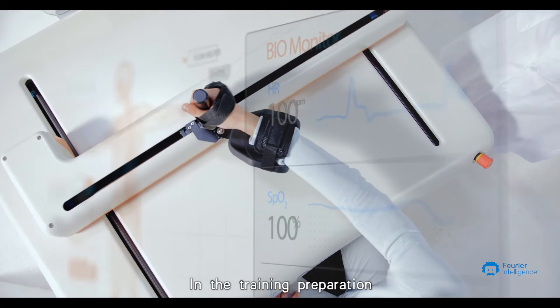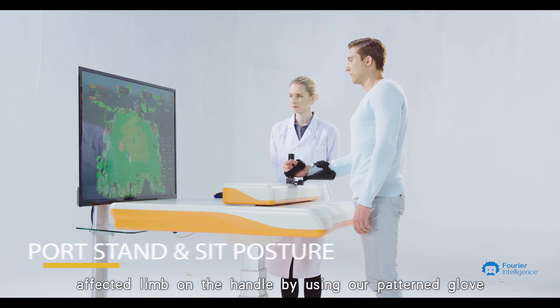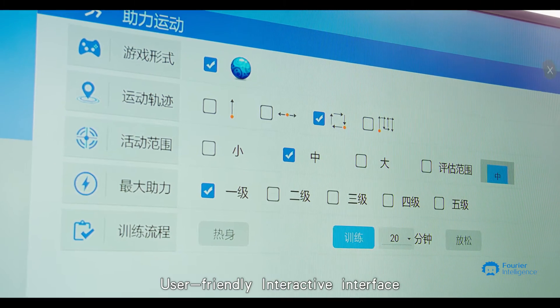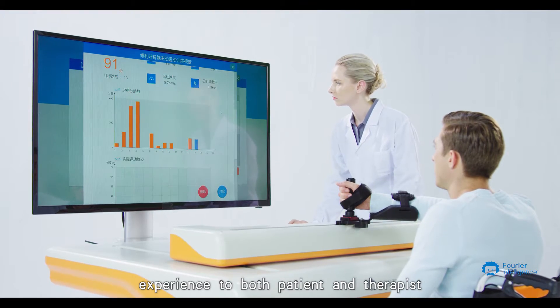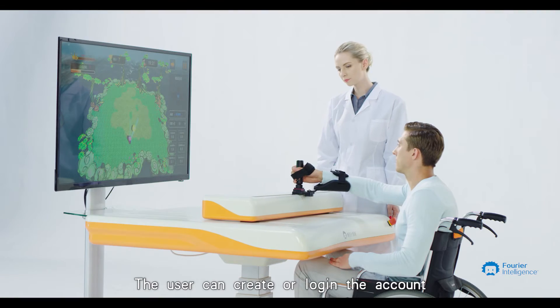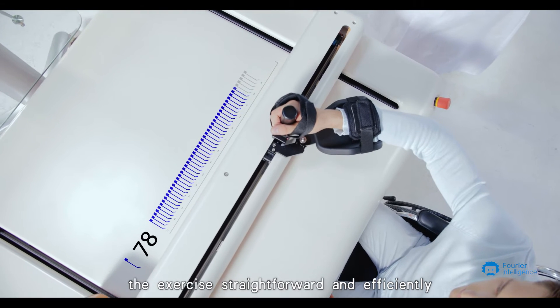In the training preparation, the therapist can directly place and fix the patient's affected limb on the handle by using a pattern glove. The user-friendly interactive interface is carefully designed to provide an exceptional experience to both patient and therapist. The user can create or log in to an account, set the training modalities, and start the exercise straightforwardly and efficiently.